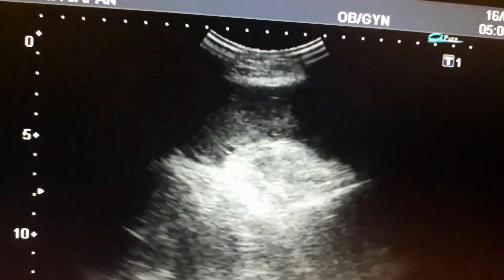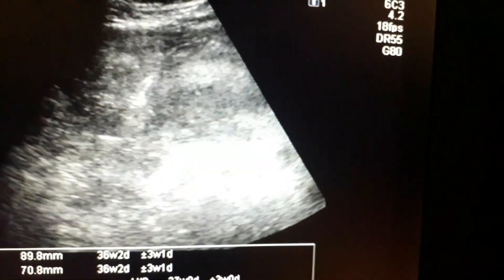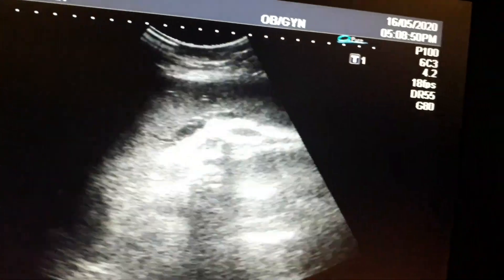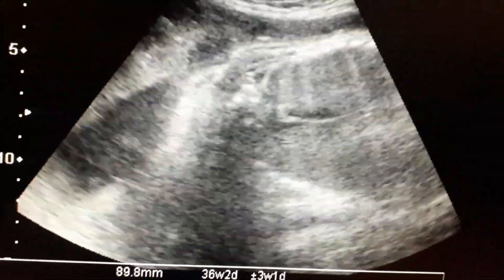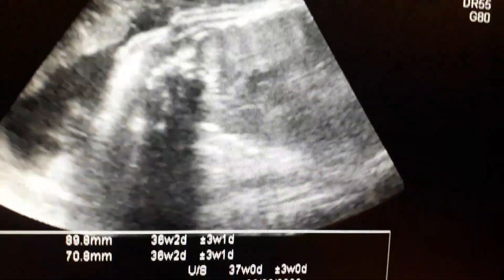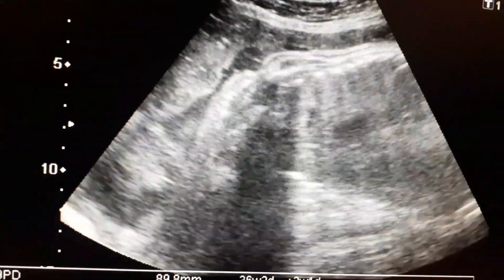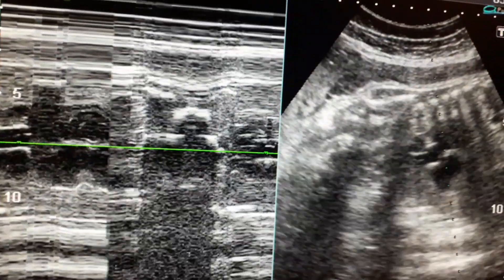You can appreciate the placenta lying in the anterior segment of the uterus, in the frontal part of the uterus, and it is grade 3 maturity. Now I am calculating the heart rate and listening to the cardiac activity. This is the waveform to calculate the heart rate.